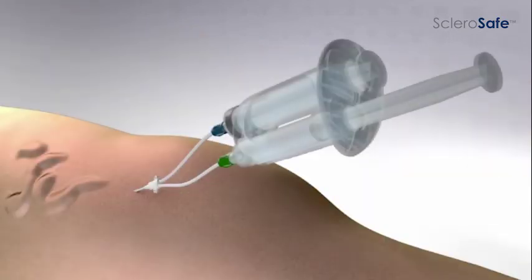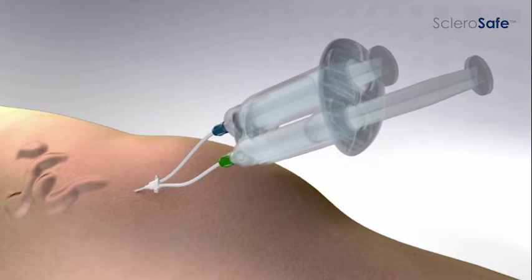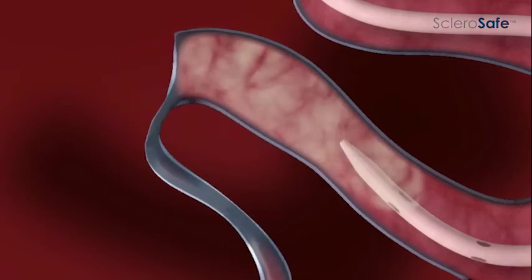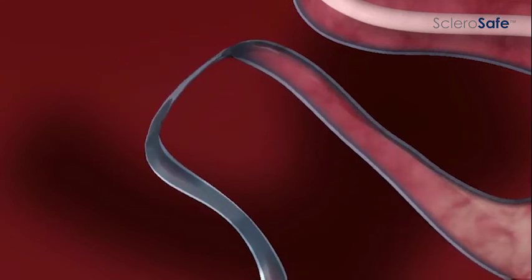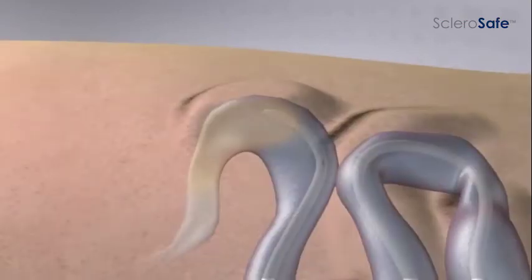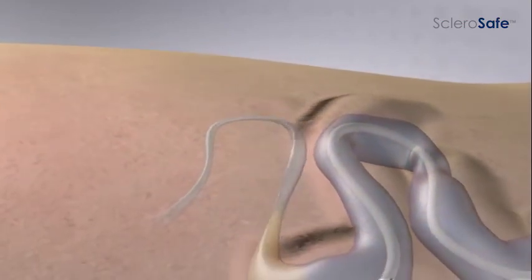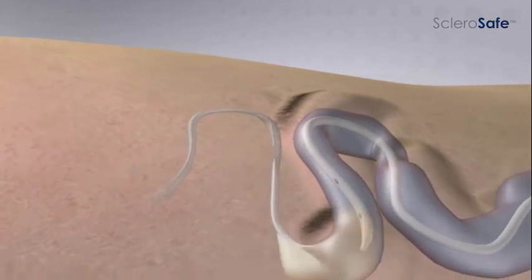At this point, the dual procedure syringe discharges the sclerosant agent from the distal end of the catheter through one syringe, while blood is withdrawn simultaneously through the second syringe. This single-hand dual injection and aspiration continues as the SclerosAfe catheter is slowly withdrawn to the level of the puncture site and removed from the body.